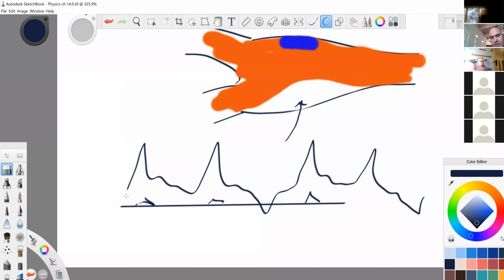when using pulse wave. I am not a big fan of this, because now you've potentially erased some important information. So I always have my reject at 0 when dealing with pulse wave, because these little doodads of information can sometimes tell us something.